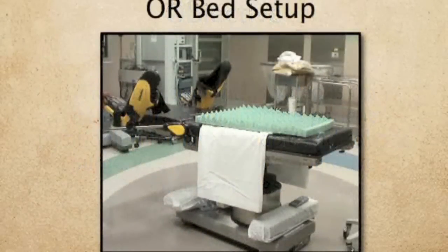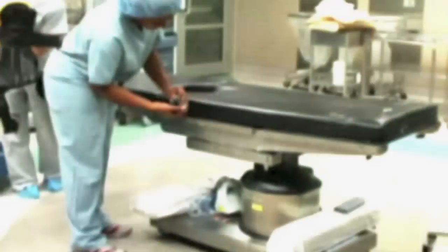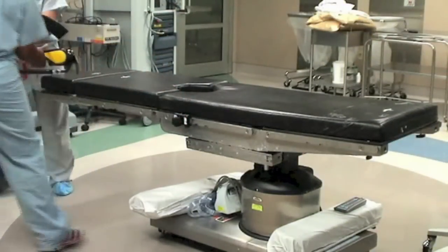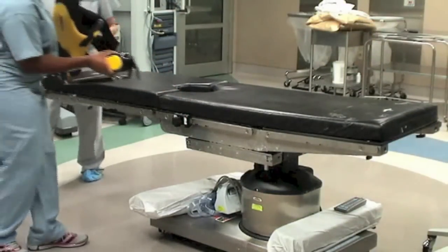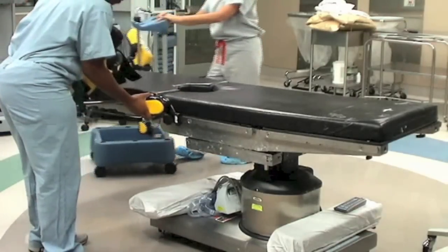OR bed setup. Our technique involves a bed sheet, an egg crate foam mattress, and boot-type stirrups. We recommend setting up the OR table to facilitate tucking of the patient arms and to prevent slippage of the patient when the patient is placed in steep Trendelenburg.